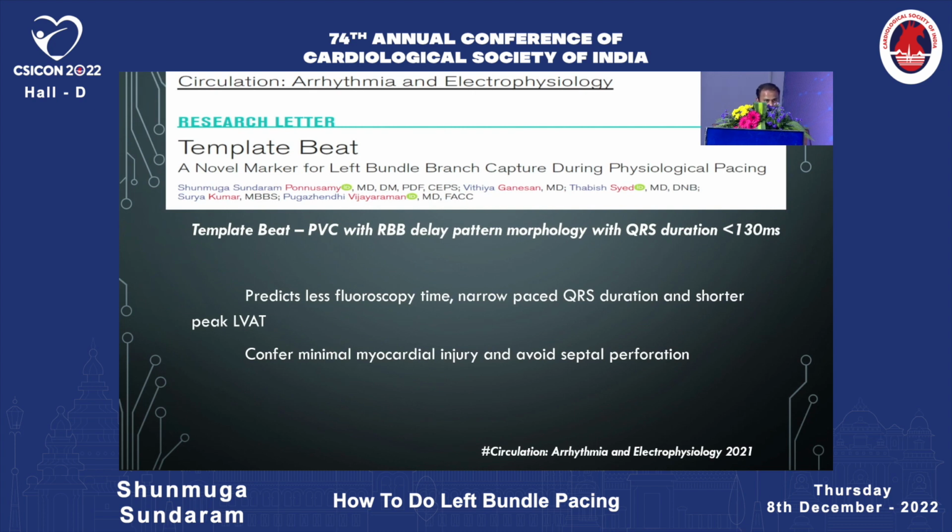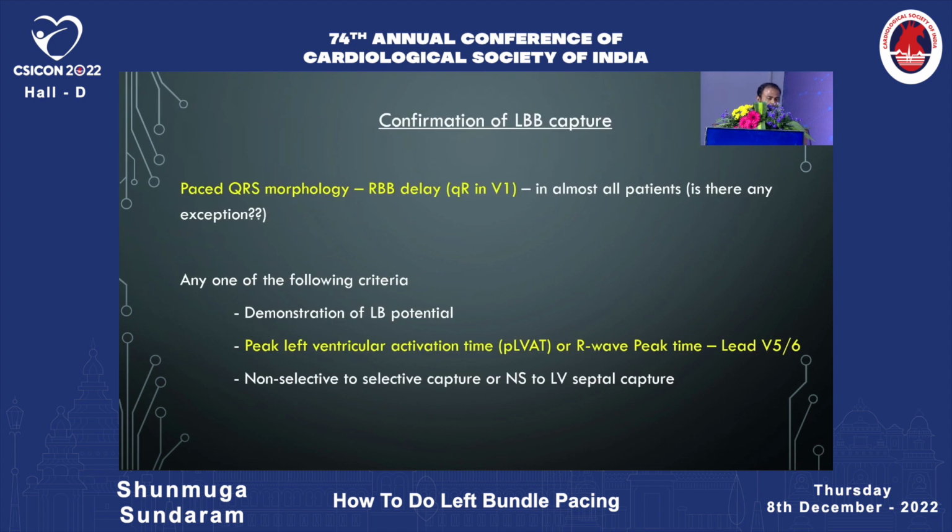We have, of course, documented with the troponin release, and in fact, it generated a better LVAT and better QRS duration. So once you deploy the lead, you have to confirm it. It's a very simplified way of confirming it. So presence of QR can be taken as a major criterion.